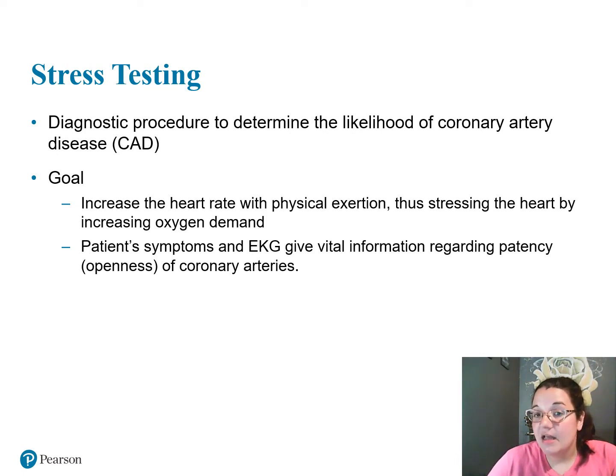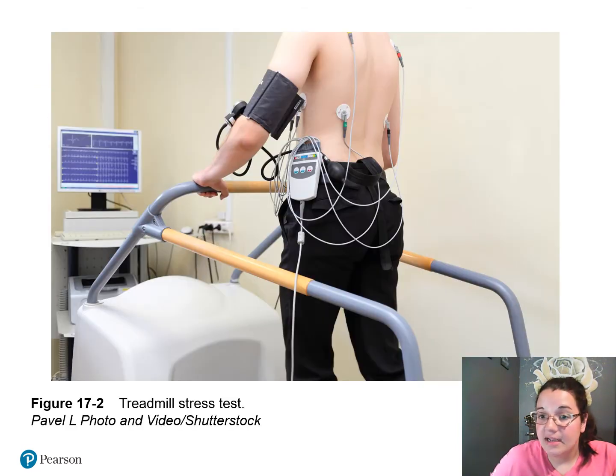And we can tell if they are open by doing a stress test. And again, a stress test is to help diagnose the likelihood of CAD. You are increasing the heart rate with physical exertion. You are stressing the heart and increasing demand.